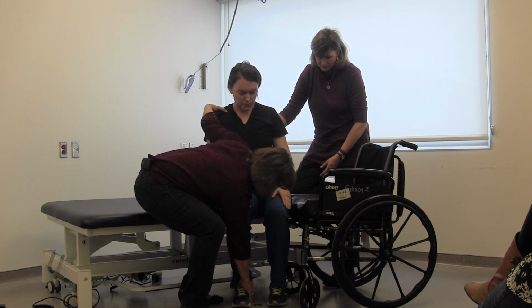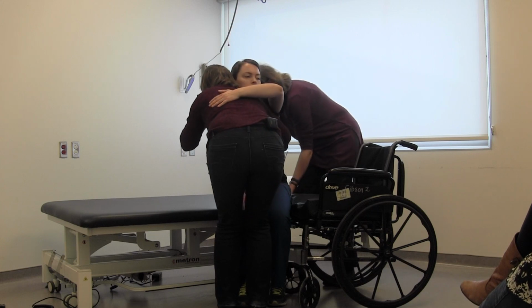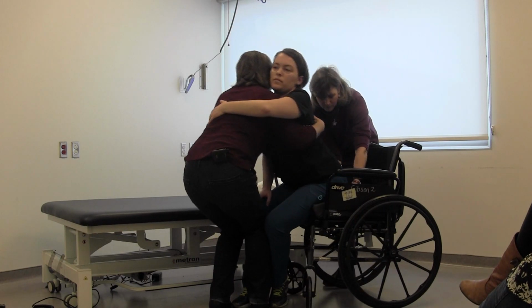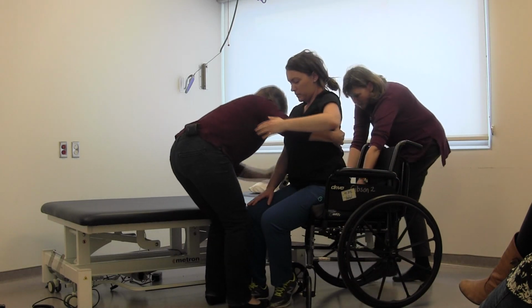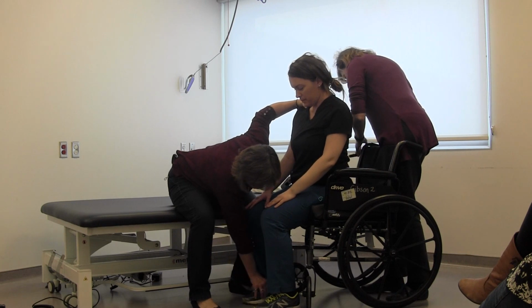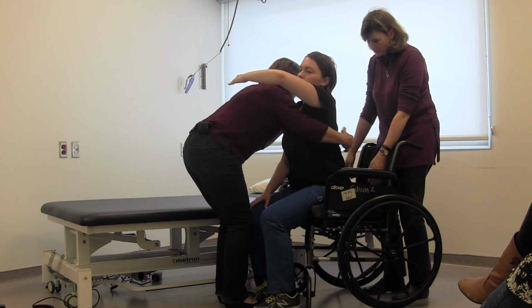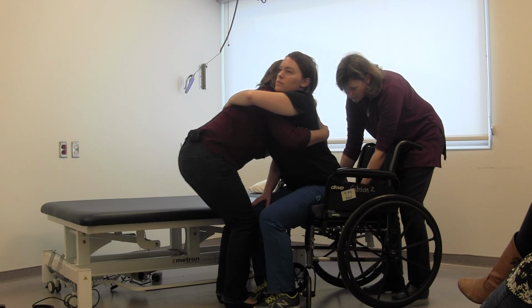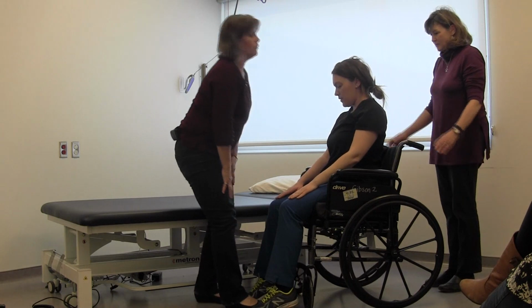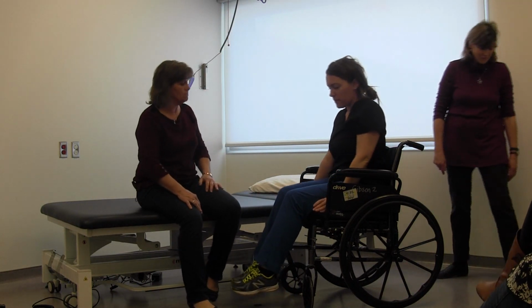We'll reset the feet. And now we'll move over to the chair a little bit. So that nice and tall. Bend and pivot. Beautiful. And you can move that foot, and I'm going to help that foot, and now we're going to move further back in the chair. Okay? 1, 2, 3, and back. Beautiful. Nice transfer. Very nice. Good. That worked out really well.